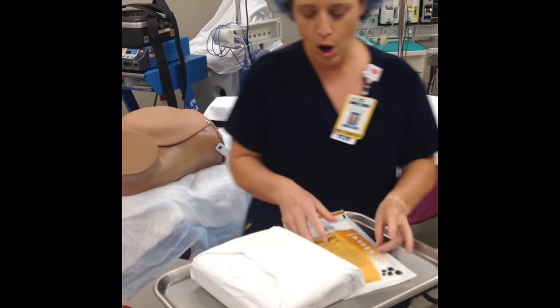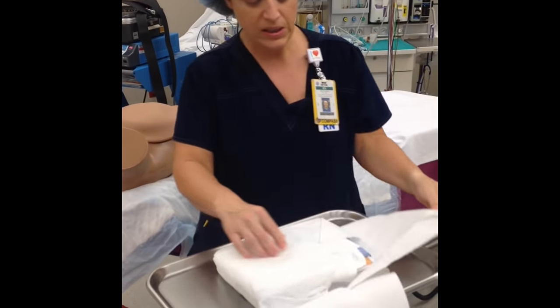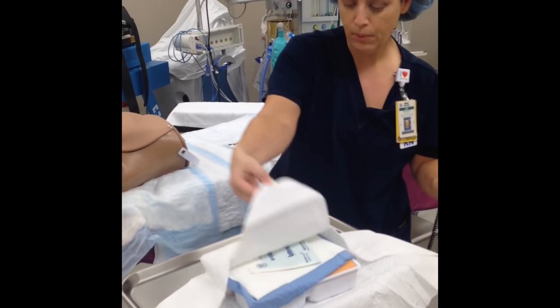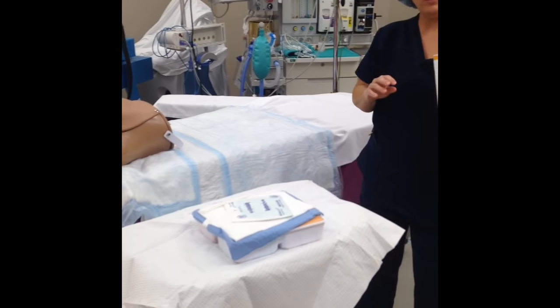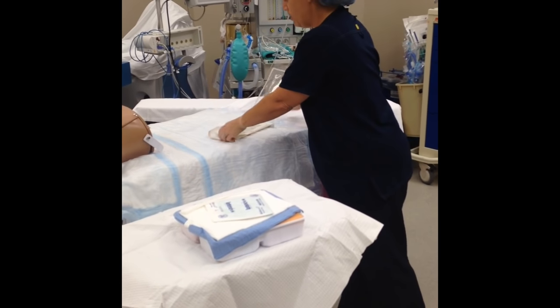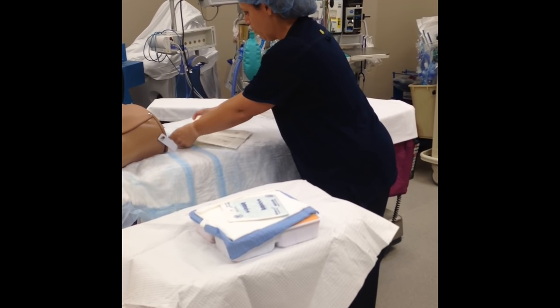We're going to go ahead and open up our prep tray on our prep table using the principles of asepsis. Make sure that your paper corners do not bounce back on your prep tray, otherwise it will be contaminated. Then I'm going to go ahead and don my sterile gloves away from the sterile field. There are some gloves provided in the kit already if you prefer — either way is fine.